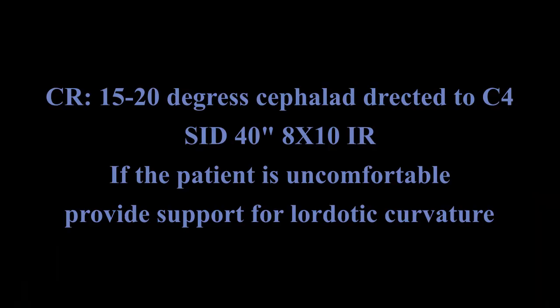Center the IR at the level of C4. Adjust the head so that the mid-sagittal plane is in straight alignment and perpendicular to the IR. Provide support for the head of any patient who has pronounced lordotic curvature. Central ray: the central ray is directed to C4 at an angle of 15 to 20 degrees cephalad.